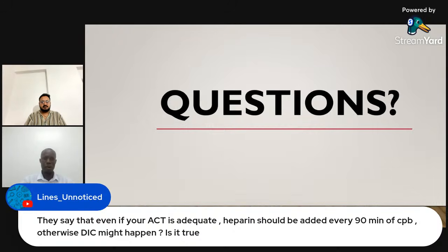Remember we said we need to maintain our ACT high. You need to play safe. Your oxygenator is very important. If you mess up with your ACT and your oxygenator fails, that's another issue. Your ACT needs to be high all through.